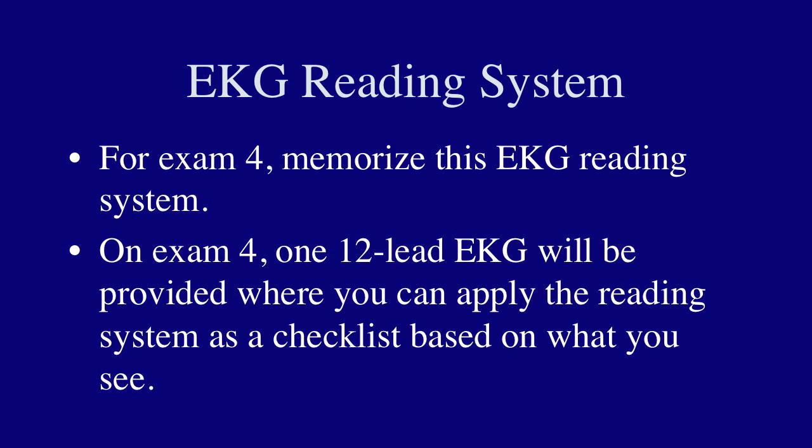The EKG reading system is something that everybody should use, so that you go systematically through an EKG and follow a checklist as you do that. There's one of these on the back of the small text. If you follow a system, you will not miss anything. If you just look at the EKG and try to pick up a few random things, you can actually miss things.